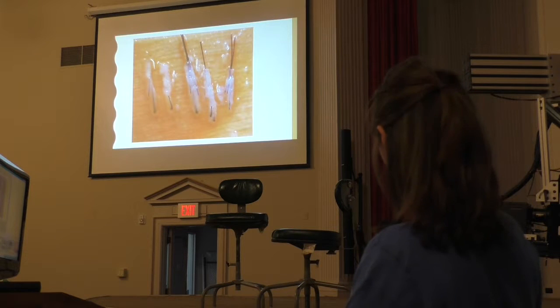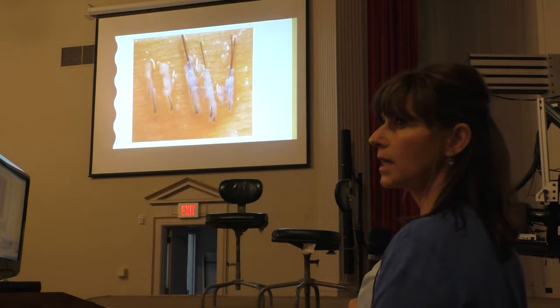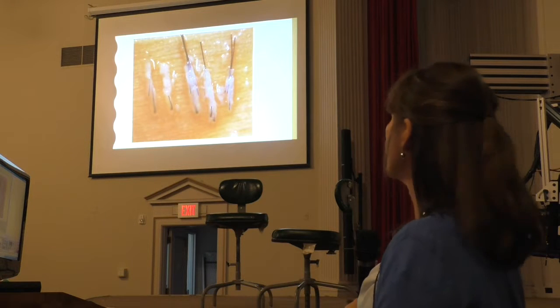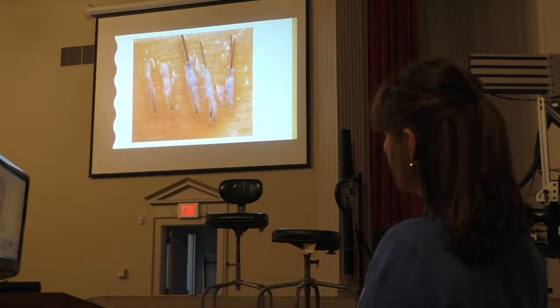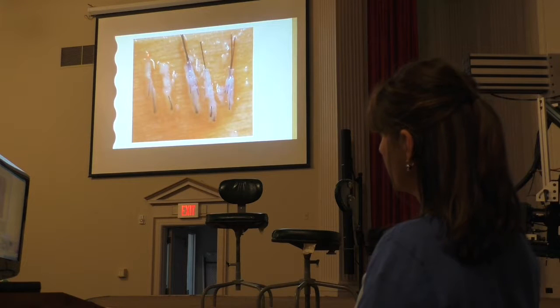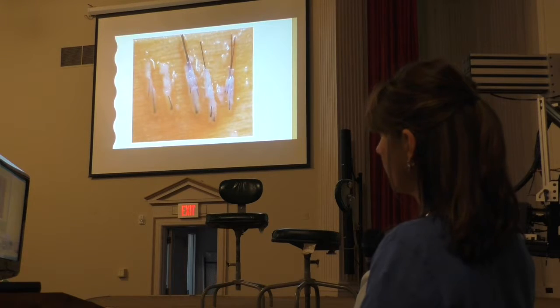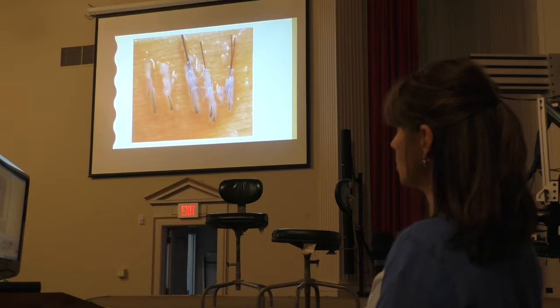From these grafts, how many would we have? Do I have any good grafts in the first one? Yes? No? How many would say yes? Do I have at least one? Okay. Actually, I don't. This is a half, bottom half, it would not survive. So if I look at the full length of the hair shaft, this has no bulb, and it's transected on both sides. This one is transected, the top is missing. The bottom, if I look at the full length, tells me about the half, it will not survive. That would say for this one, this is even a third, it would not survive.